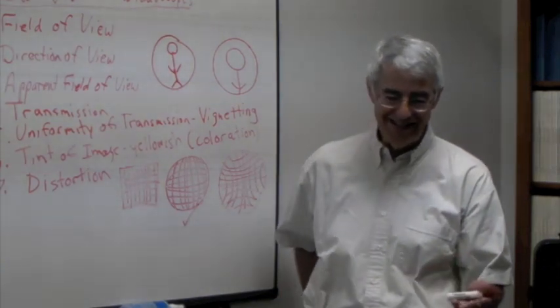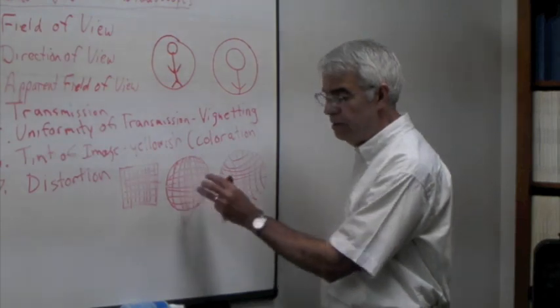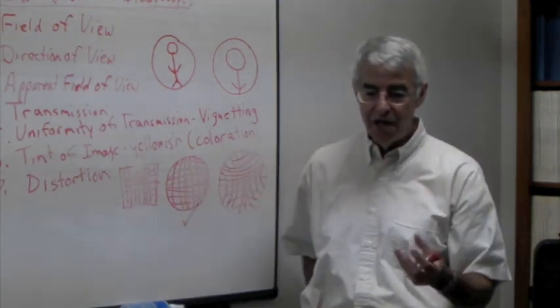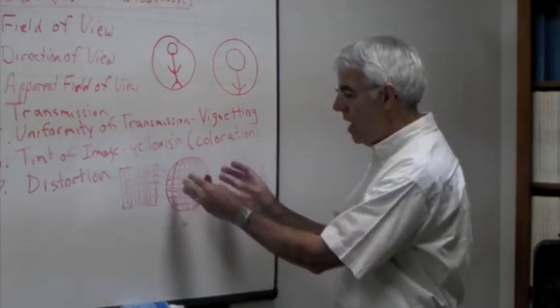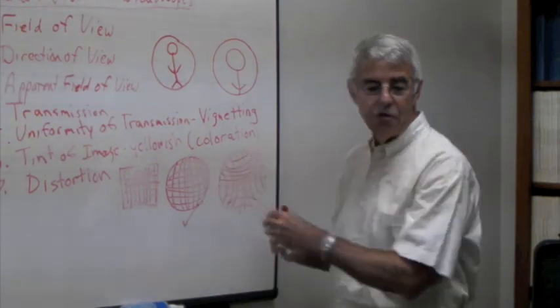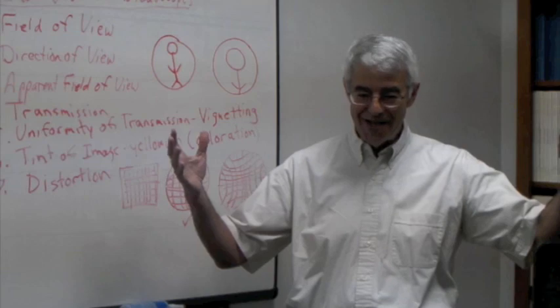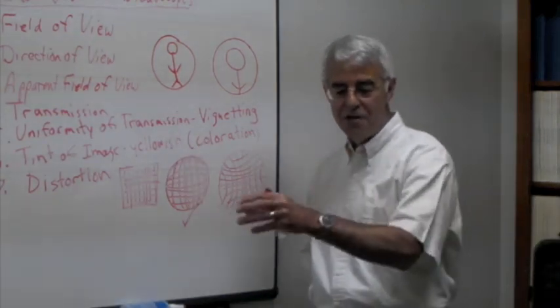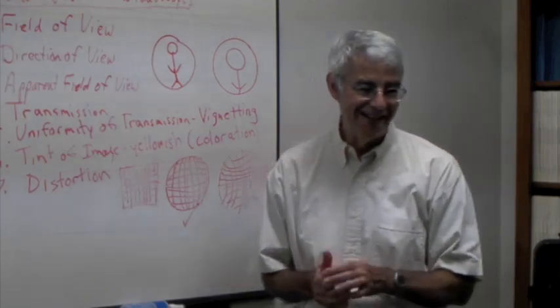characteristic. Here's the spin. When you're looking at something in the center, you have a large magnification, so you can see it clearly. Whereas at the edge, you've brought in the field of view so that you can see a larger area of the anatomy. Wow. And then you can move it into the center for a clearer view. How's that? That's pretty good.